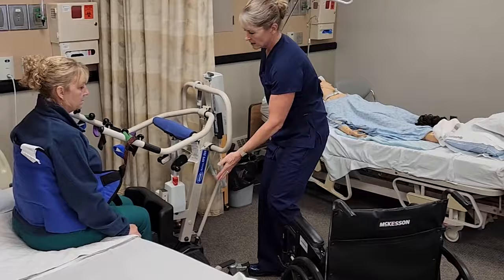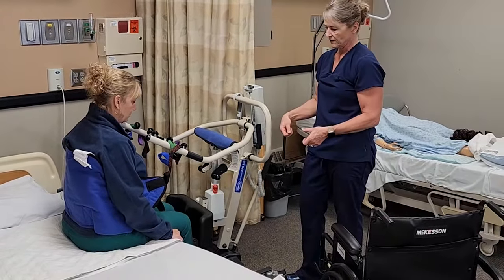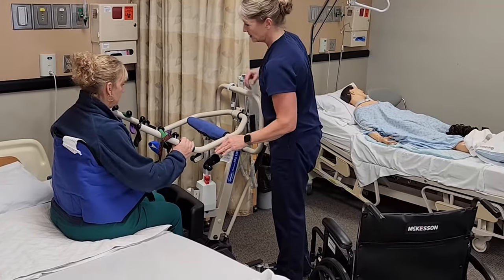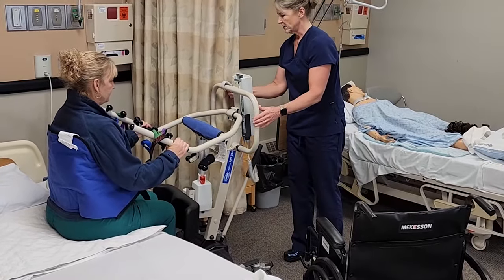Some sit to stands also have a buckle behind the knees, so if they do have that, you're going to want to fasten that before you have them stand up. I'm going to have you put your hands up here on both sides. Are you still feeling okay? All right, we're going to go up.